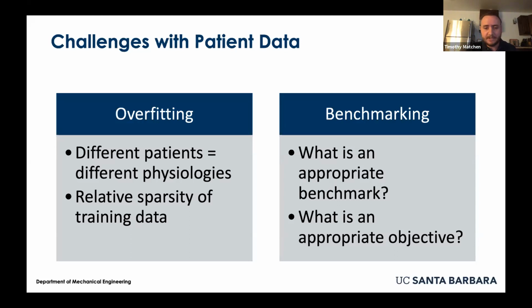And then what we decided the ultimate objective was, was to say whether or not we should expect in a subsequent window to see a burst or not see a burst based on some current window or some current input stream of data. And this had to be receptive to both the current state of your system, which in this case is the current power spectral density of the local field potential, and also subject to whether or not we're actually stimulating our system, so whether or not control is actually turned on or off in the next step.